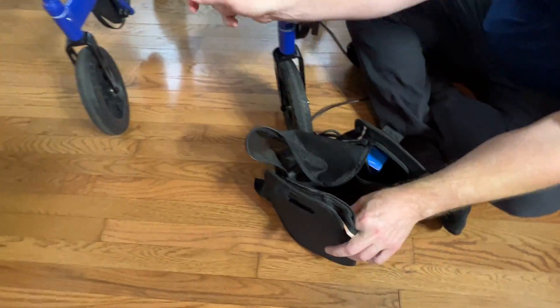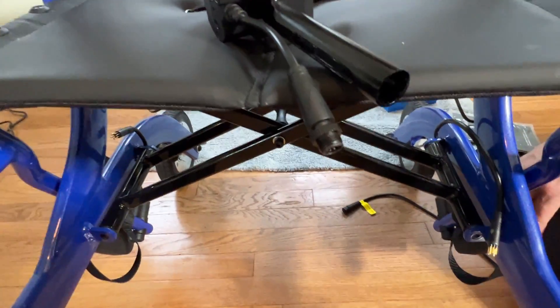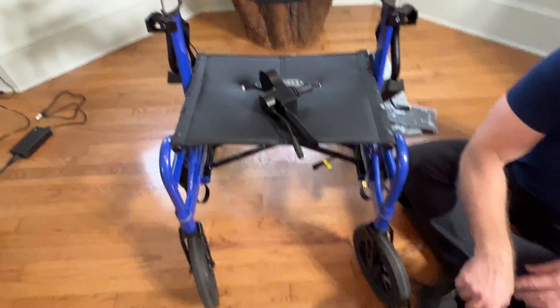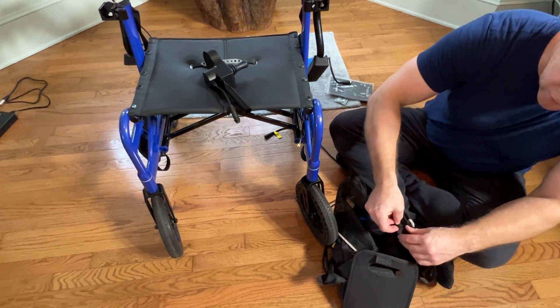If we've detached this, we can just use this as a regular walker or regular push wheelchair all day long. So let's go ahead and get this zipped up inside the basket.